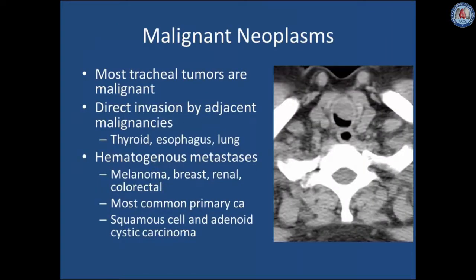Most tracheal tumors are malignant. The trachea can be involved secondarily by adjacent malignancies such as carcinomas of the thyroid, esophagus, or lung, and hematogenously by metastases from melanoma, breast, renal, or colorectal cancers. The most common malignant tumors of the trachea are squamous cell carcinoma and adenoid cystic carcinoma. Shown here is a focal endoluminal mass causing significant tracheal obstruction from a hematogenous metastasis from melanoma.